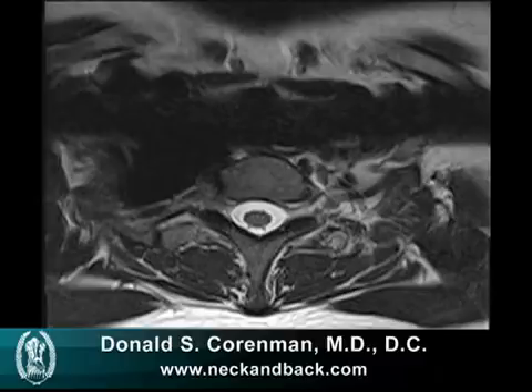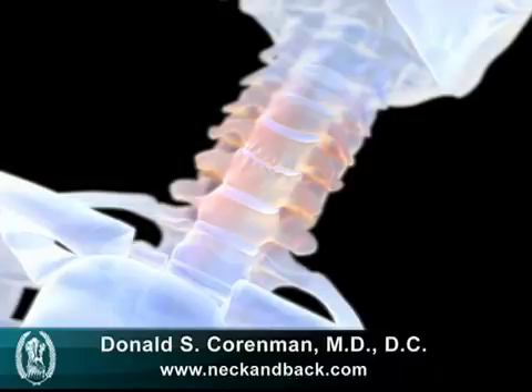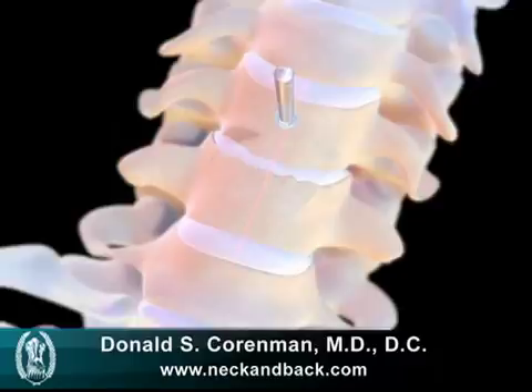We first start with a small transverse incision on the side of the neck, and we dissect directly onto the anterior part of the neck. We put in these two small distraction pins called Caspar pins that allow us to pull the vertebra apart to its normal height. Typically, these vertebra have collapsed at least halfway.